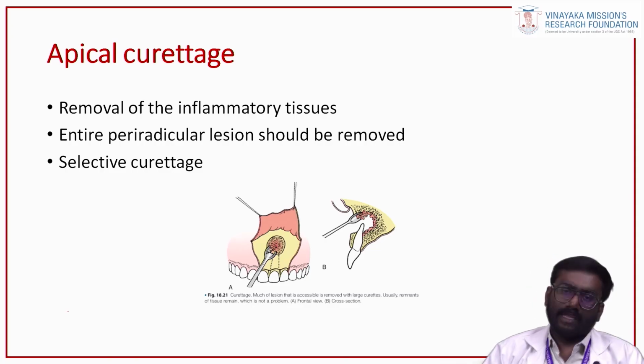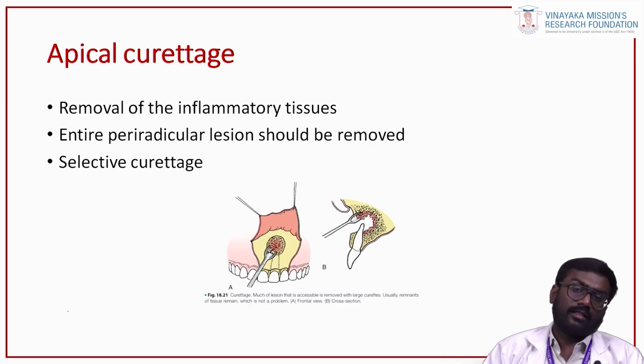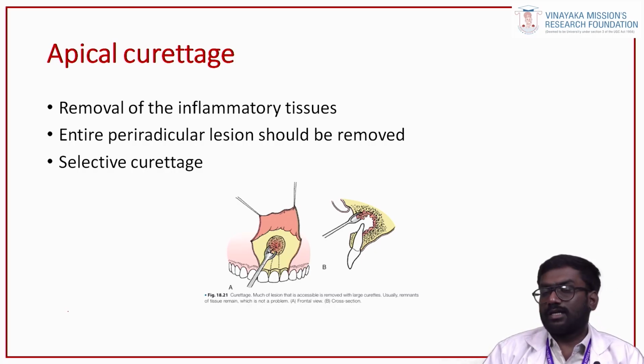One clear indication that you have done this properly is that once you have curetted the periradicular cavity and there is no soft tissue attached, that is, the granulation tissues are completely removed, the cavity will be very clean without any bleeding. If some part of the tissue is left, there will be constant bleeding. Curettes specially designed for the interradicular area can be used, or you can use dry gauze pieces and scrape all the radicular surfaces and the interradicular area. The bony cavity should be free of the cystic lining, granulation tissue or any sort of infection.